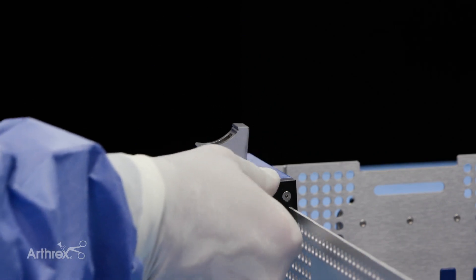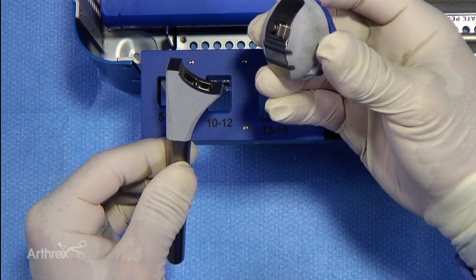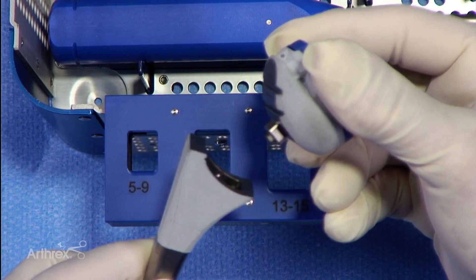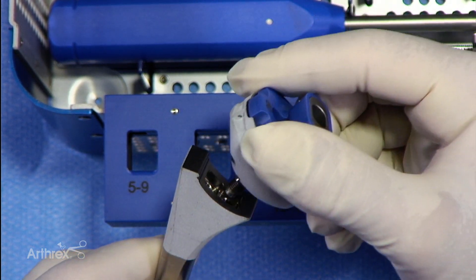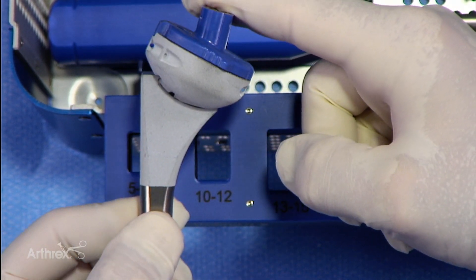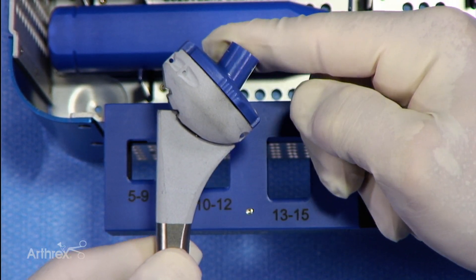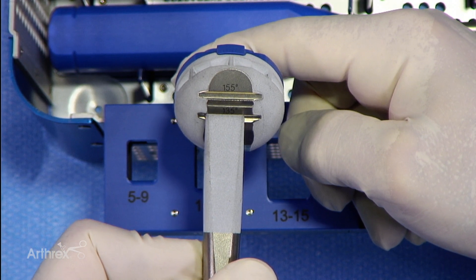To do that, let me first show you by taking this back out of the stand. You can see the angle of inclination here, and then on the back of the cup we have markings here for the 155 and the 135. To put this in the proper alignment, this flange would go into the position of the 155 in this manner if that was the inclination desired. As mentioned, the most commonly used inclination is 135, and that's what we're going to demonstrate. That's what it should look like visually, and you can confirm that by looking on the back and seeing that it's in the groove for the 135.